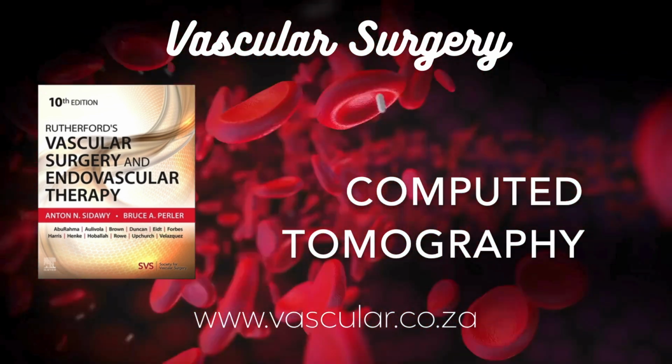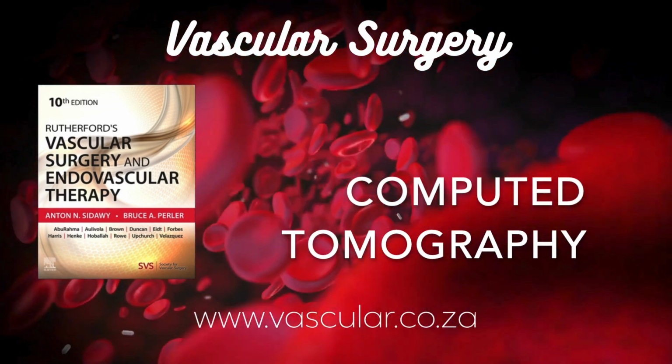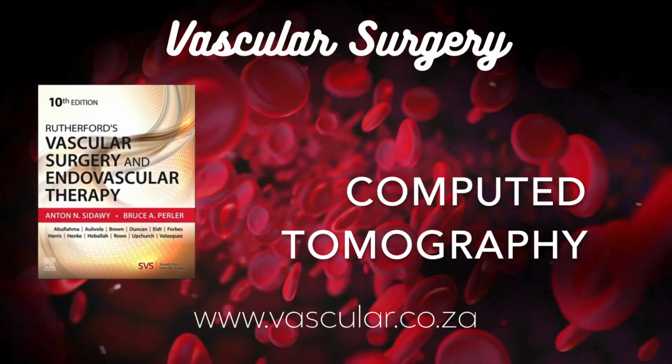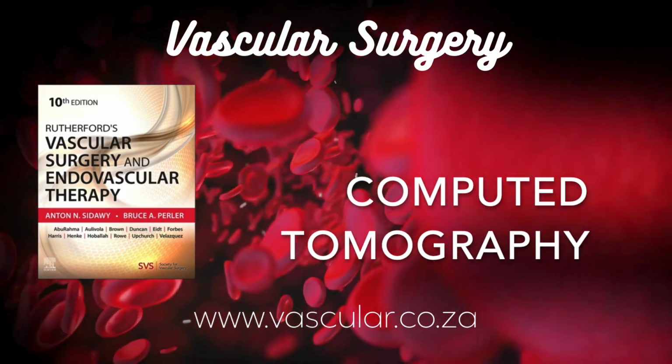The main one, especially in smaller vessels, is differentiating dense calcium in the vessel wall from the bright contrast inside the lumen. Sometimes it can make a stenosis look worse than it is. Interpretation needs care. What about arteries in the neck?